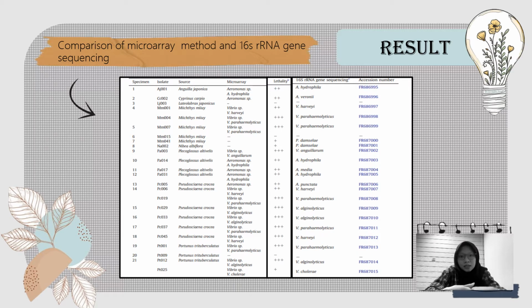The fluorescence signal intensity for healthy and negative hybridization samples was below 200, while positive hybridization samples exceeded 1000. Experimental infection tests show that most of the symptoms caused by this pathogen were similar to those found in naturally diseased fish.